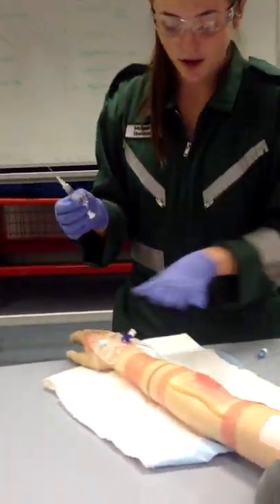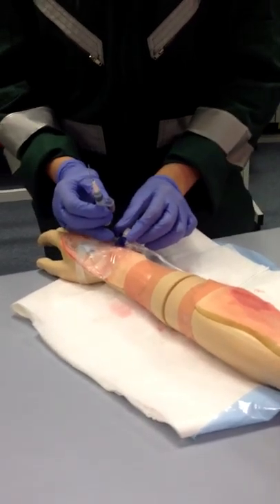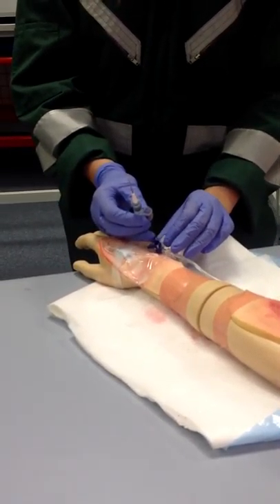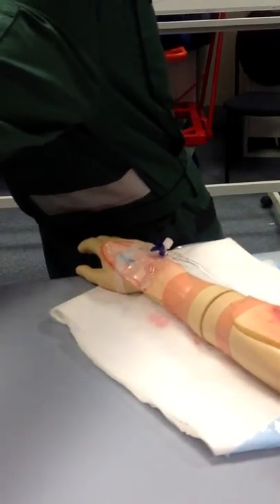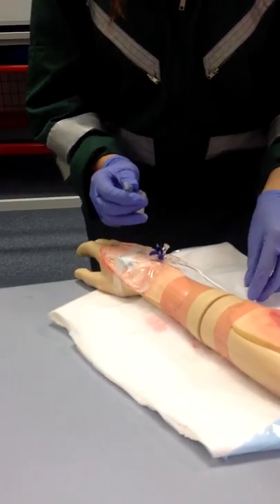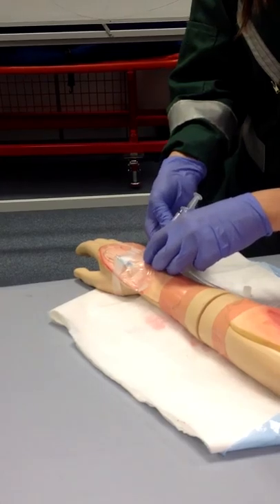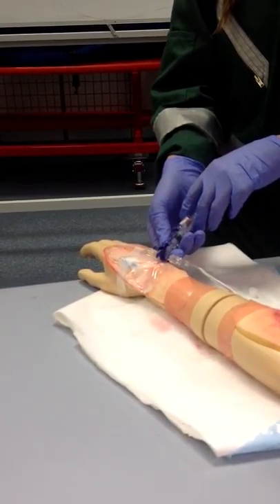We've got our IV and our fluids set up here. I'm just going to turn the IV fluids off and undo the cap here. I'm just going to remove that first and throw that away, then undo the cap. I'm then going to insert the drug here and turn it on. I'm now going to push the adrenaline all the way through.